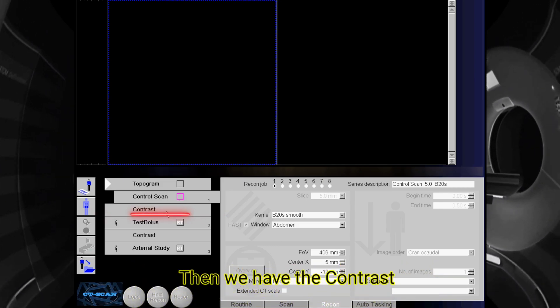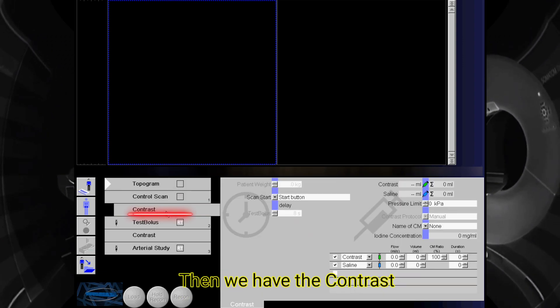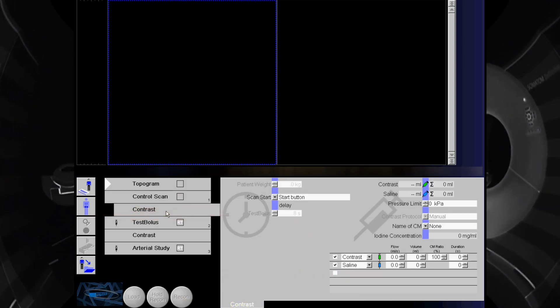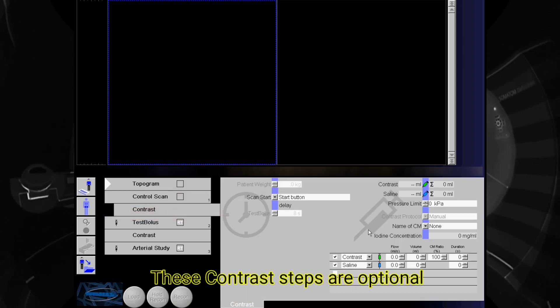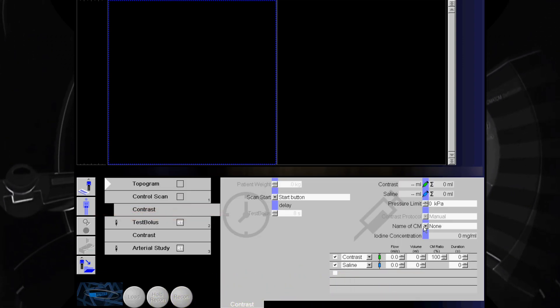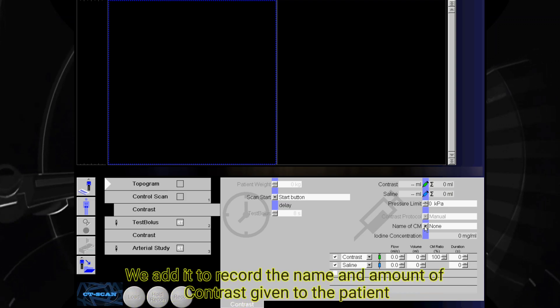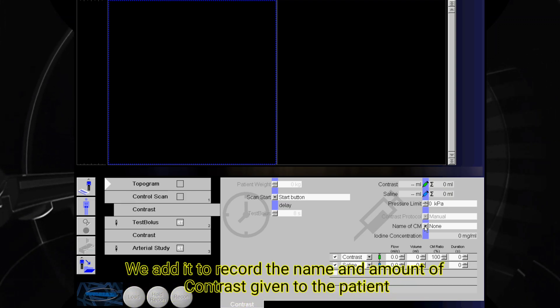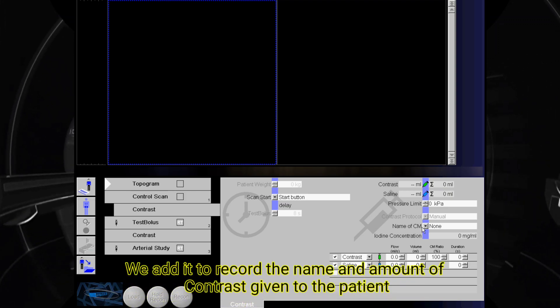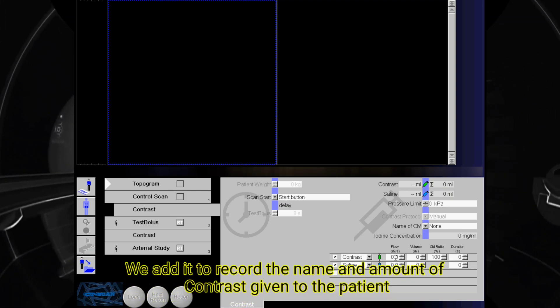Then we have the contrast. These contrast steps are optional. We add it to record the name and amount of contrast given to the patient.